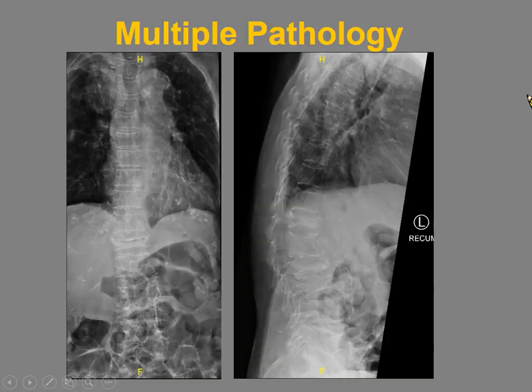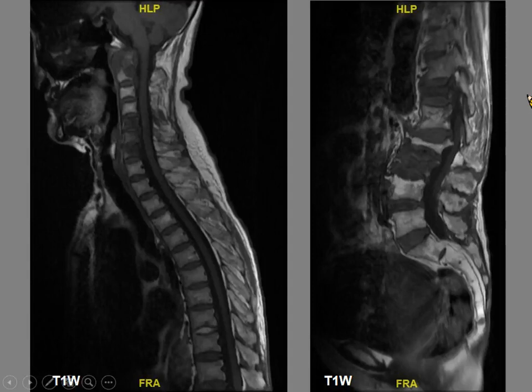Now, the other diagnostic challenge is in patients with multiple pathology. And this may seem a bit ironical because MR is good for telling us the presence of multiple pathology. This is an example, fairly typical. Elderly patient who comes in after a fall, complains of back pain, and you can see there are some fractures like so. And usually MR is requested to distinguish the cause of the fractures. In this case, you can see that the patient has got metastasis, but there are also old compression fractures.